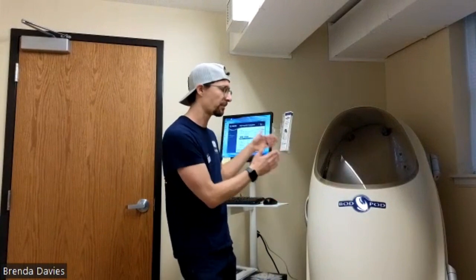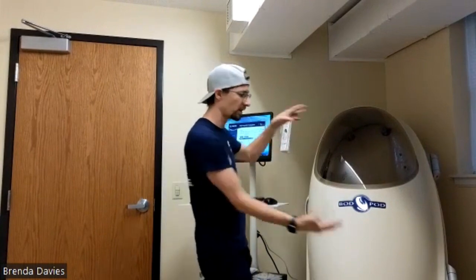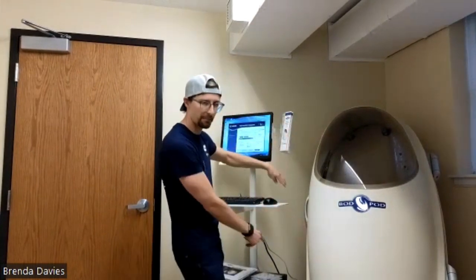If the pressure on one side is being manipulated from the environment, then the volume can't be accurately assessed over time. So you want to have this in a room that's pretty climate controlled, so that the pressure being modified on one side of this chamber by the membrane behind the seat is going to give you an accurate volume every time.